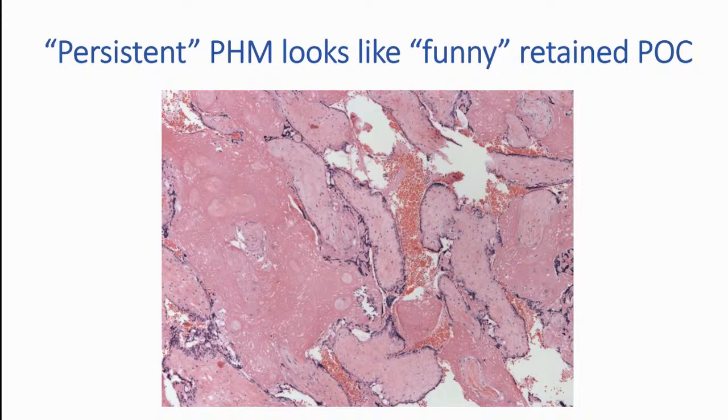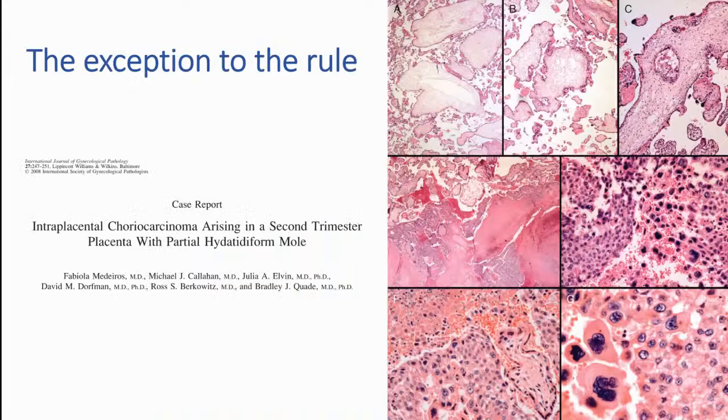But here's one of the exceptions to the rule, and I'll just point out this is one of my former fellows and organizers of this conference. She worked this case up. It truly was a partial mole, and I'll show the data to back it up. Unfortunately, the original pathologist escaped noticing that there was an intraplacental choriocarcinoma in the same placenta, and it was left.